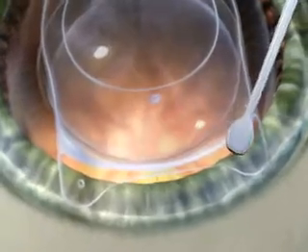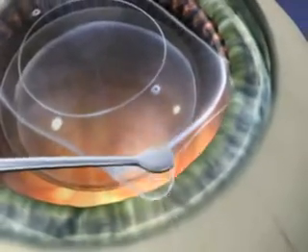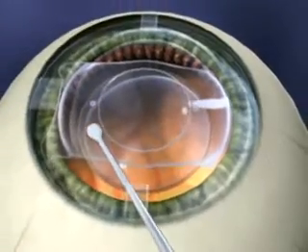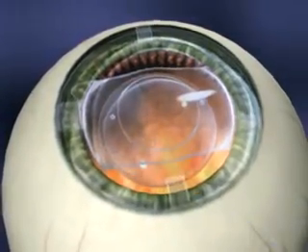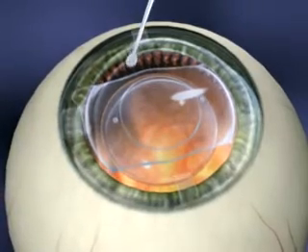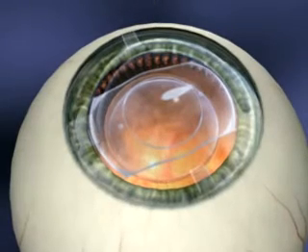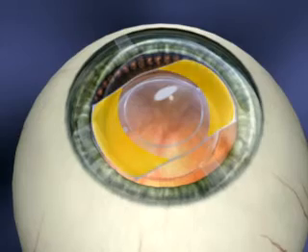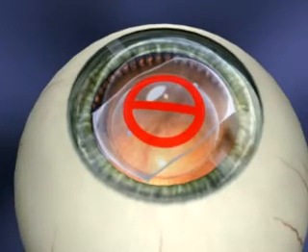Using the ICL manipulator, position the distal footplates first while the pupil is maximally dilated. Once the first footplate is under the iris, continue with each of the footplates until they are all posterior to the iris. Avoid excessive rotation of the ICL once it's in place. Once positioned behind the iris, subtle adjustments are achieved by manipulation on the lens body, between the footplate and optic. Never depress the optic itself — this is the thinnest part of the lens.